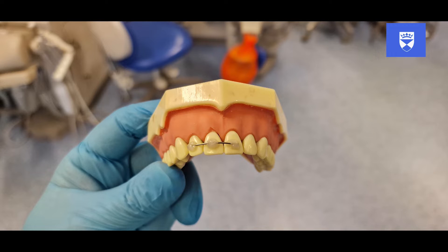After the appropriate time, the splint must be safely removed. The purpose of the splint was to stabilize the teeth, allowing time for the periodontal ligament damage or fracture to repair or stabilize. We must be careful not to splint the teeth for too long. Detailed information regarding splinting times can be found in the International Association for Dental Traumatology Guidelines.